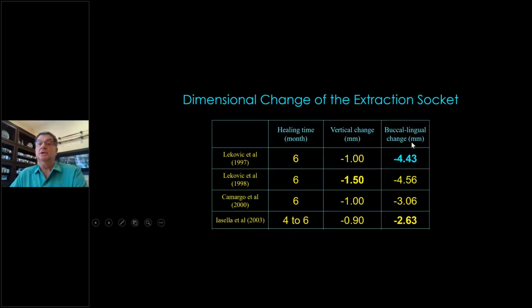Now this is unacceptable. And I looked at these data and I said, how could I accept putting an immediate implant in and getting 2, 3, 4 millimeters of buccolingual change? And that was the key why everybody said, oh, this is a problem. And you saw some of the side effects. However, when I looked at this, I said, but that isn't what some of my colleagues who were doing immediates were showing. They were showing much better results. And by putting it to the palate, they didn't see this big problem, a 4 millimeter change. So I went back to this literature, and what did I find? What they did was they opened flaps. And I'm so glad Dr. Elaskary hopped on that. If they open the flap, that's what this research shows.